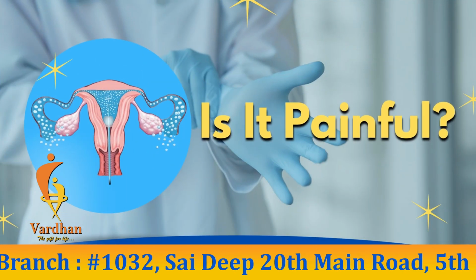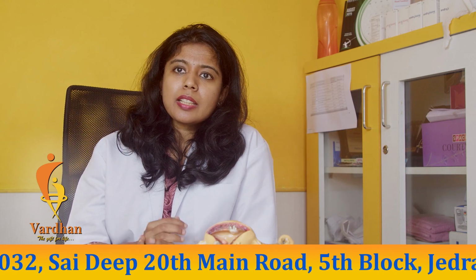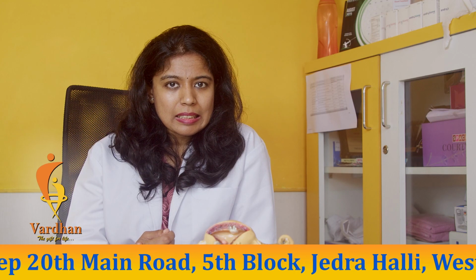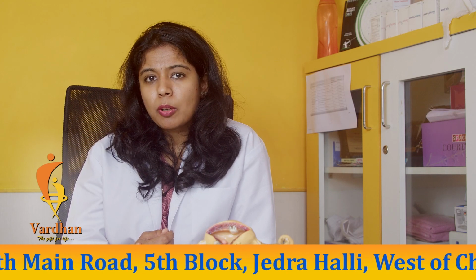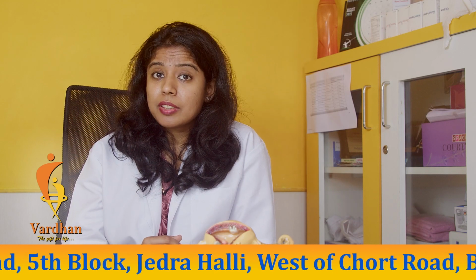Is it painful? Yes, it is not like an ultrasound. Since we are going to put a cannula inside your uterus, it does cause mild to moderate discomfort in patients, but again the pain threshold is different for different women.